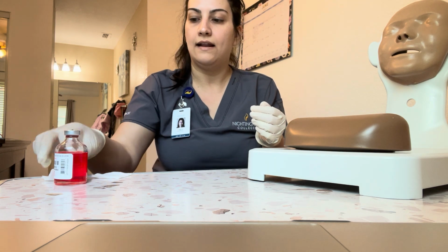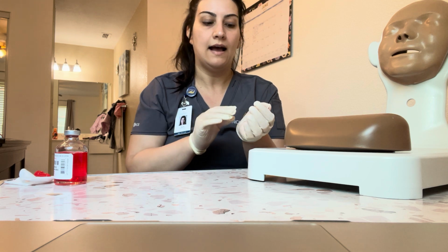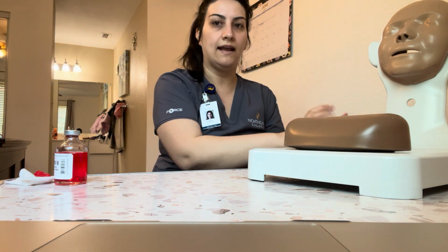I will discard all the rest of this and put this back in the medication room. I will take off my gloves here, dispose of that, perform hand hygiene, and go ahead and document my results.